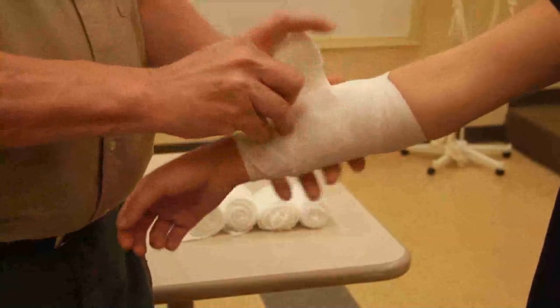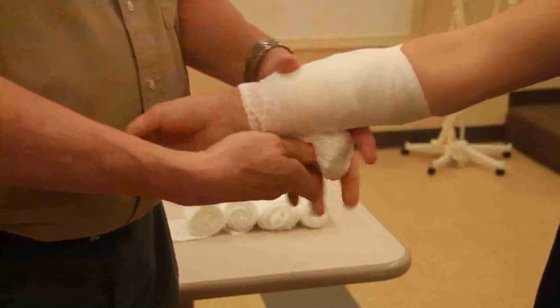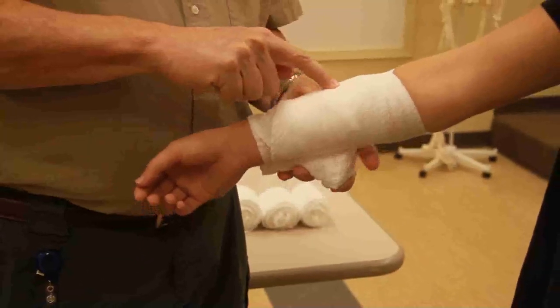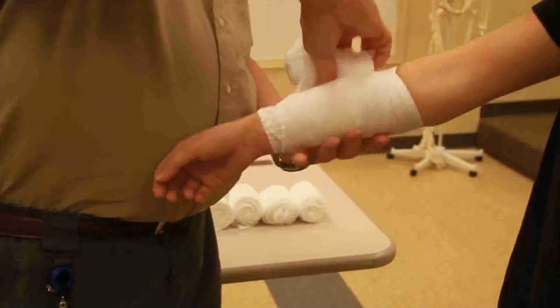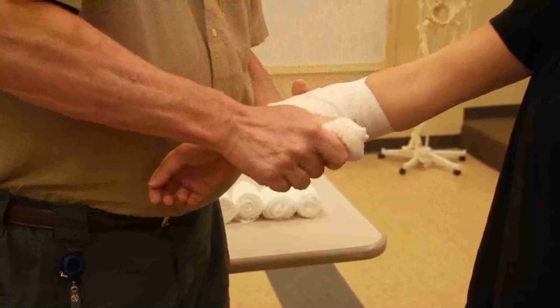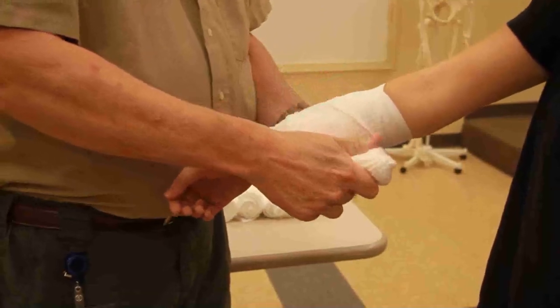Now I want to put direct pressure over the site. I'm going to bring the bandage around and move it over to put direct pressure over the site with that.